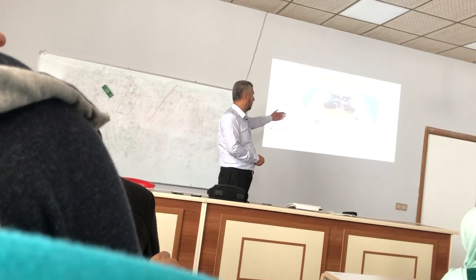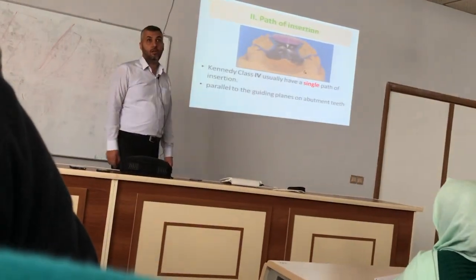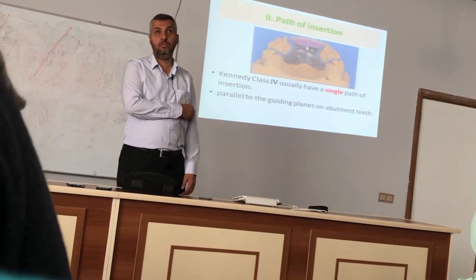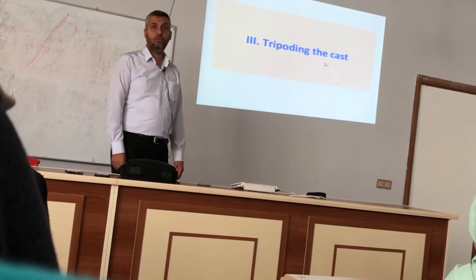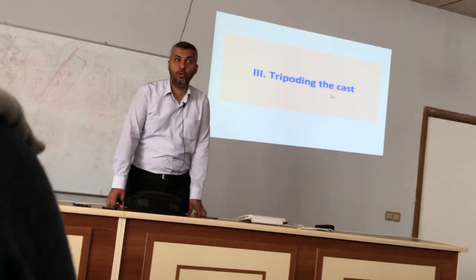Okay, you say class 3 and class 4 a single path of insertion. Any question on insertion? Tripoding. What is tripoding? You take it in your lab. Tripoding.